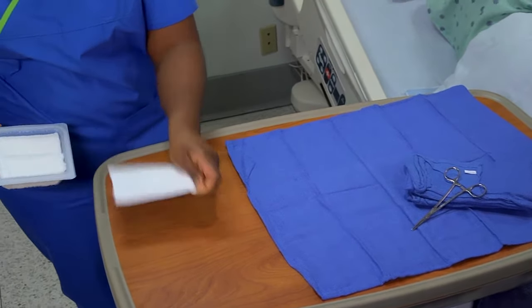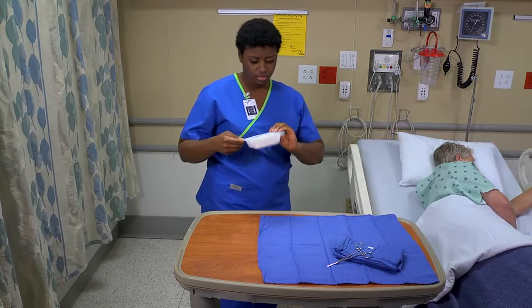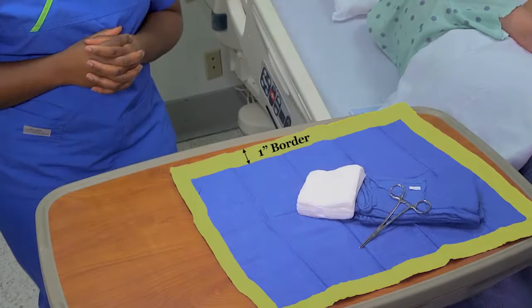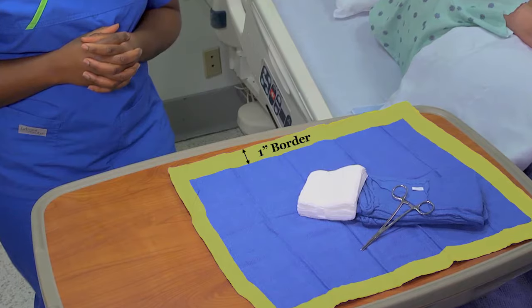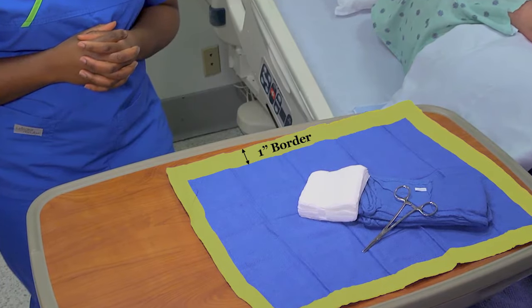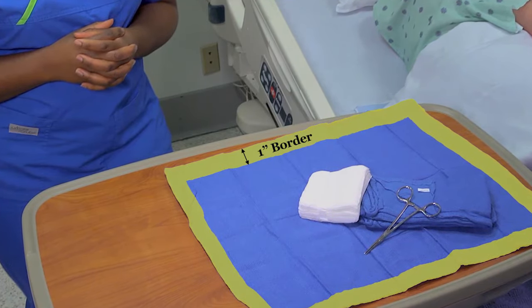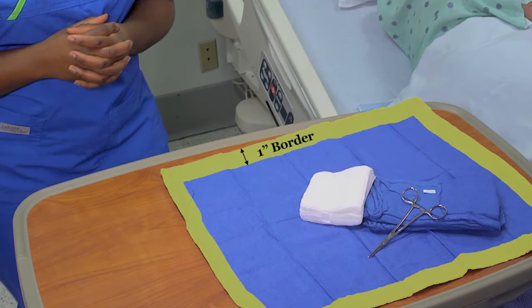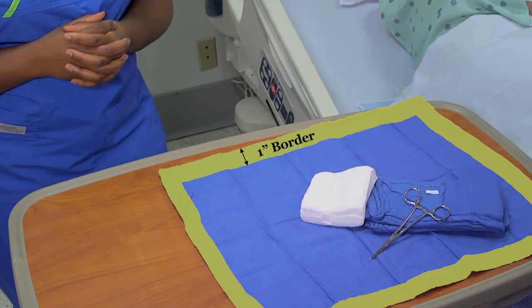Remember, don't reach across the sterile field, and don't flip or toss objects onto it. Keep in mind that a 1-inch border around the edge of the field is not considered sterile. Discard the outer wrapper of each sterile item. Repeat this process to add other sterile items to the field as needed.